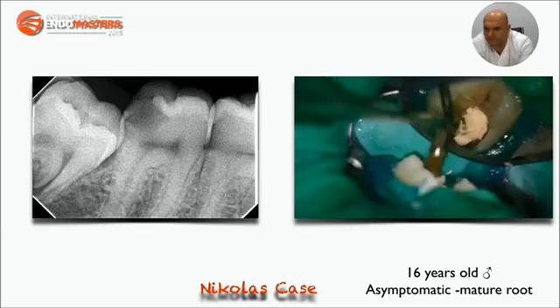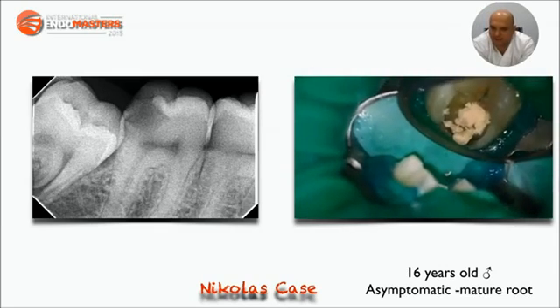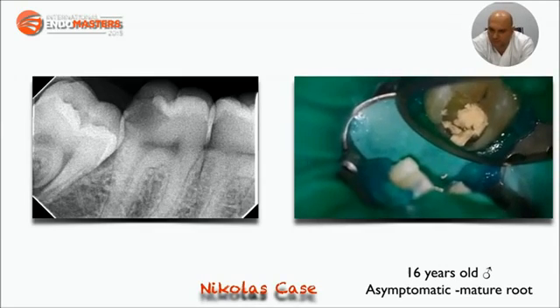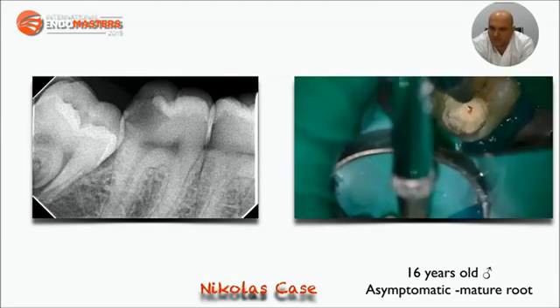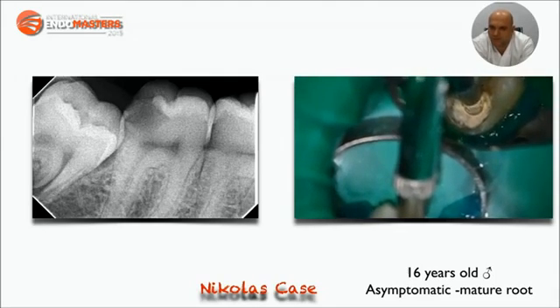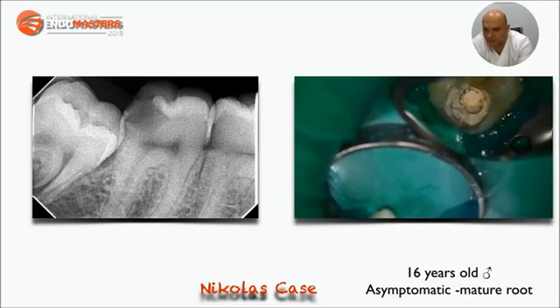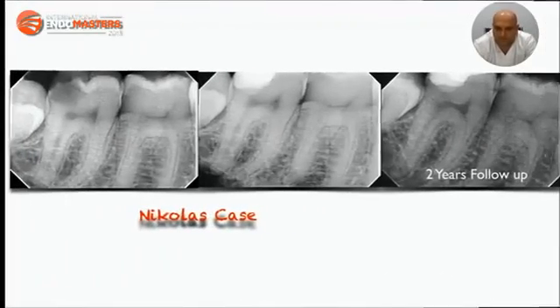You can wait for 12 minutes for the material to set. After setting of the material, you can proceed, without the need of protection of Biodentine, with the final restoration, a composite resin restoration of the cavity.